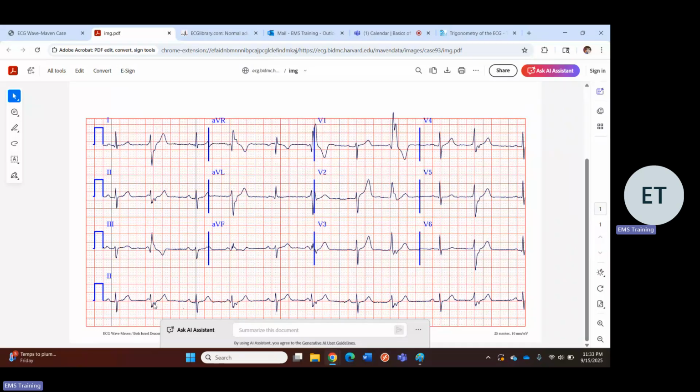That makes me think it's a retrograde P wave with a premature junctional or a premature ventricular complex. That little notch right there, that's a P wave in there. Well, some sort of AV node dissociation is happening. See, it's an AV node class 1, type 3, subsection F, header 4, rule number 9, type 2. I don't like that verbiage though.